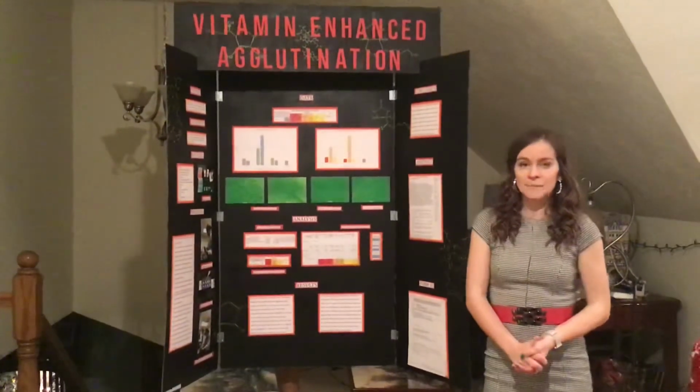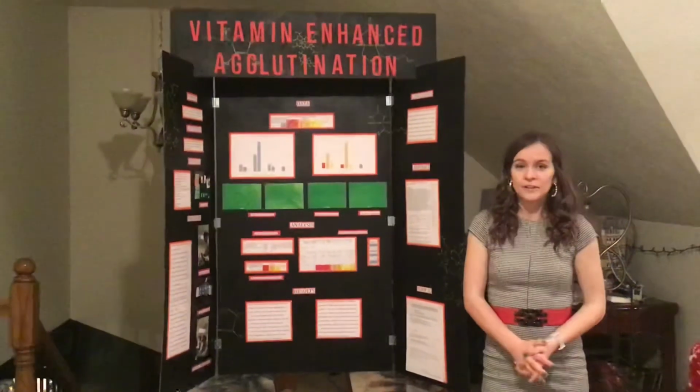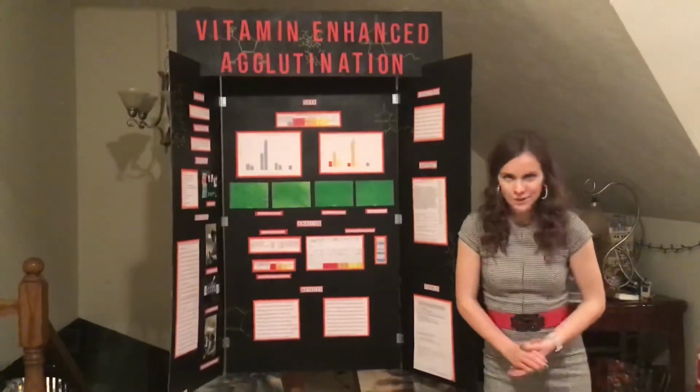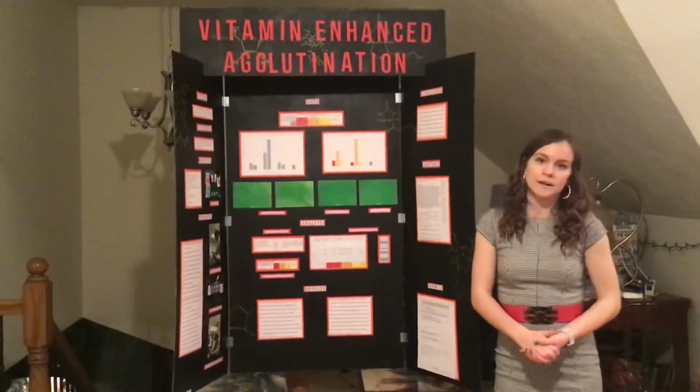I used 3 different types of vitamins, vitamin B12, vitamin C, and vitamin H, at 2 different concentrations of 10 and 100 milligrams per milliliter. My hypothesis was that vitamin C at 100 milligrams per milliliter would cause the greatest increase in efficacy of antibodies.